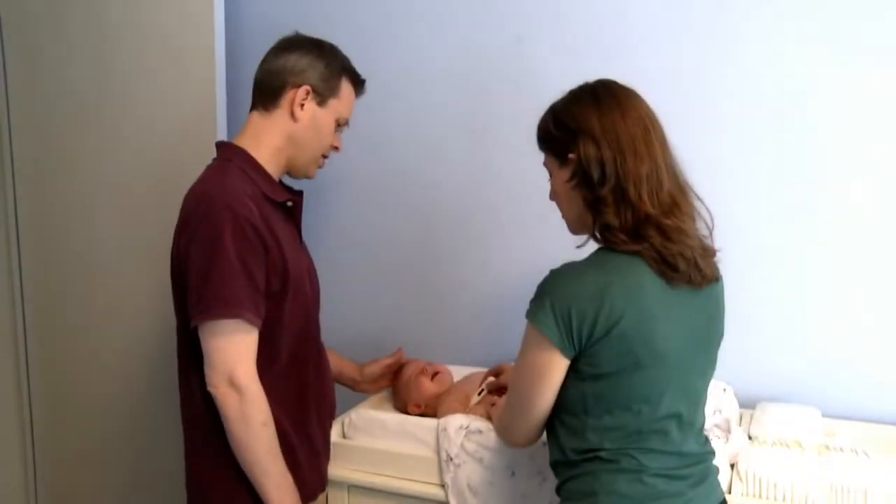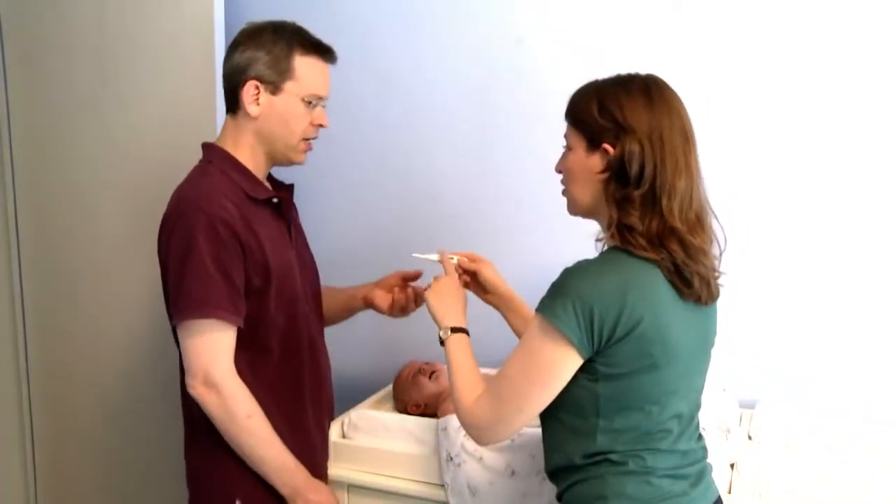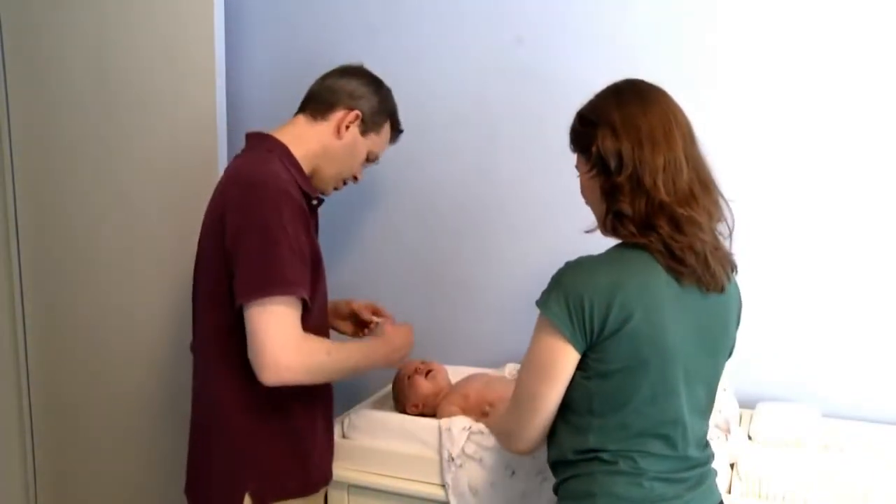Keep in mind that while the axillary temperature is good for a quick check, if you call into the doctor's office, your pediatrician will definitely want to know the rectal temperature because it is the most accurate. You don't have to wait until your baby is crying from a fever to take the temperature for the first time. There's nothing wrong with practicing how-to.